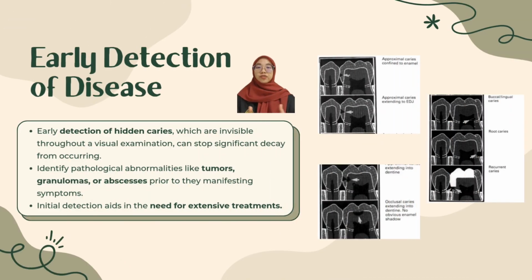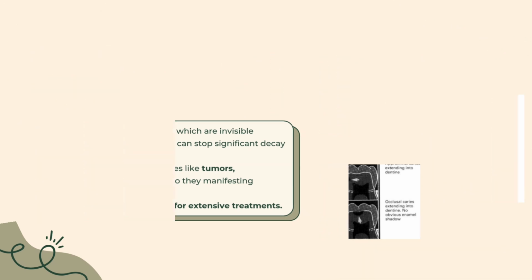Dental radiography offers numerous advantages, particularly in early detection, treatment planning, and also advanced imaging. So the first one is early detection of disease, such as hidden caries, which is one of its most valuable benefits. These caries, which are not visible during regular visual examinations, can be identified using dental radiographs. Moreover, dental radiography helps in spotting pathological abnormalities before symptoms appear. By catching these issues earlier, patients can avoid the need for more extensive or invasive treatment later on.